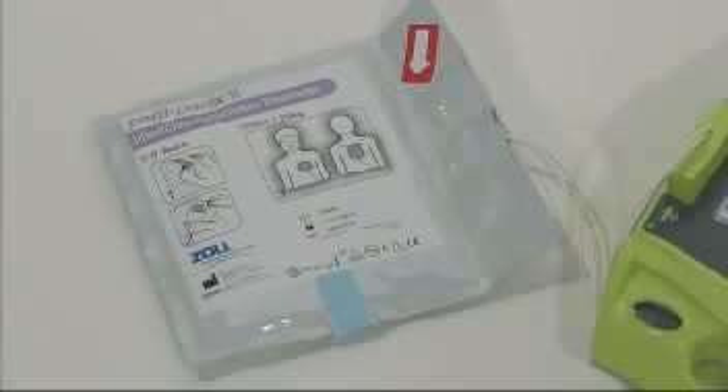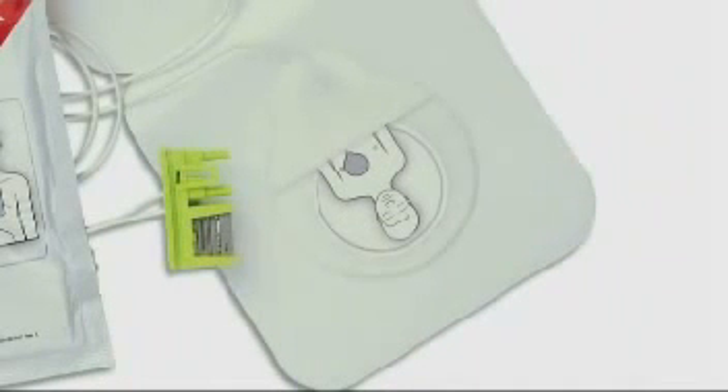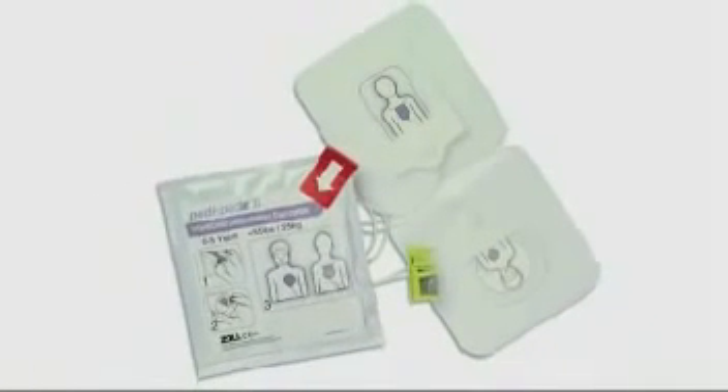The AED Plus will recognize that the pedi-pads are connected and announce 'pediatric pads.' Place the electrodes on the child according to the graphics on the package. The round electrode should be positioned on the chest and the square electrode on the back. Return the child onto their back before following further AED Plus prompts.